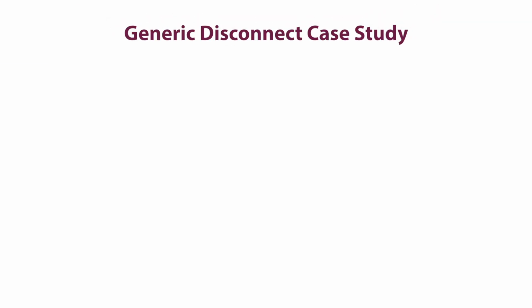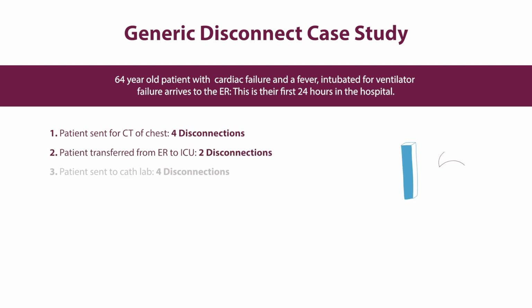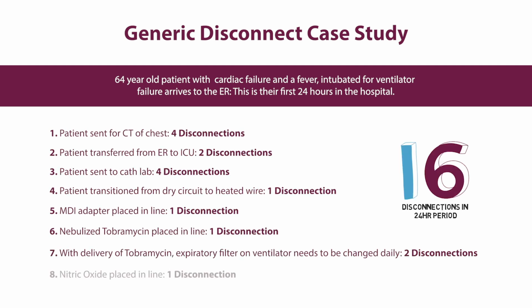Although circuit disconnections are thought of as brief or infrequent, this is a quick example of an intubated patient arriving to the emergency room. As you can see, to implement therapy and transport the patient, there are several circuit disconnections putting patients' lungs at risk of injury from collapse and re-expansion, as well as exposure of the clinician to airborne pathogens.